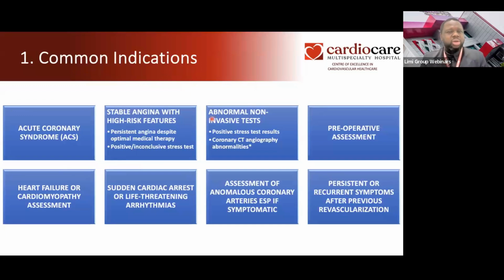They've had a stent done or they've had coronary artery bypass grafting surgery done before, and they are still having persistent symptoms. All of these are just a few indications, but these are likely the most common reasons. Anybody having chest pain with a heart attack now must have a coronary angio, typically within 60 minutes of the chest pain starting. Don't wait one day, don't wait till the next morning before you refer. It is critical because they could die.